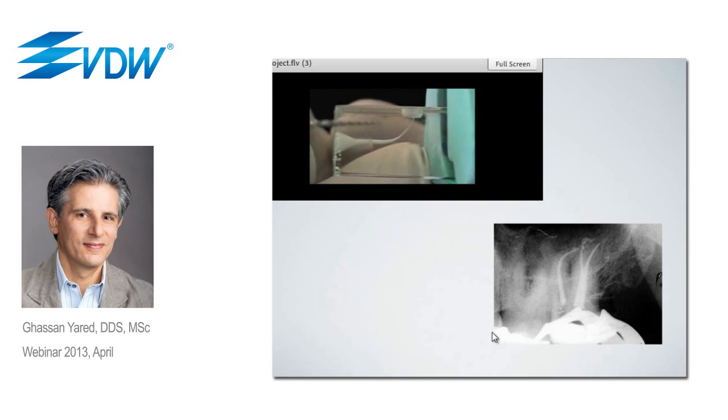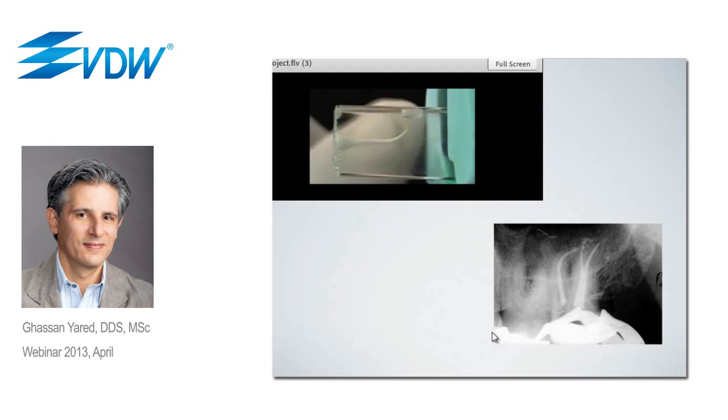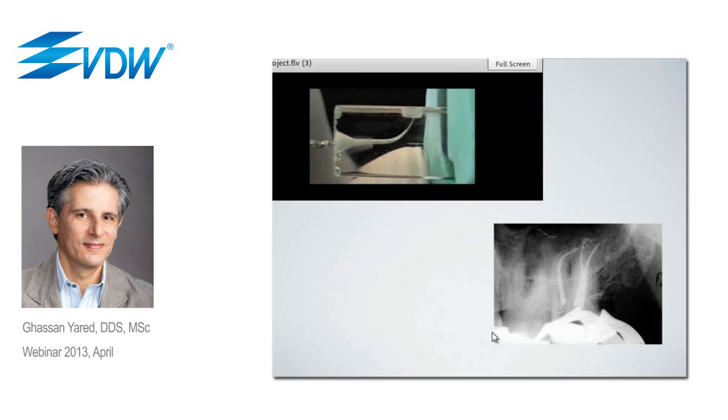I will discuss later in the presentation the clinical aspect of the technique using the reciproc instrument. You can see also on this slide the radiograph showing the second maxillary molar. The 3 canals that you see here were also prepared with only one instrument without creating a glide path and without using hand files prior to the reciprocating instrument.